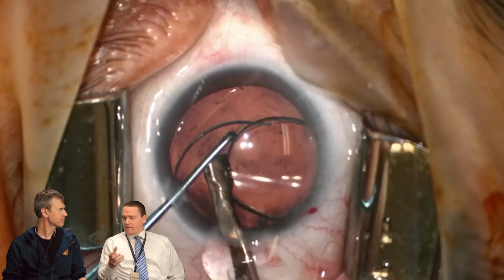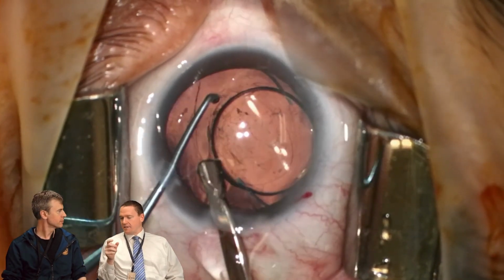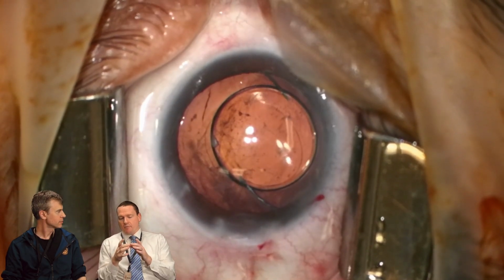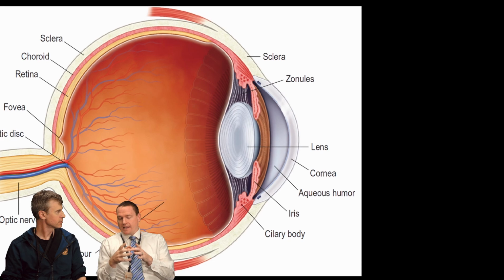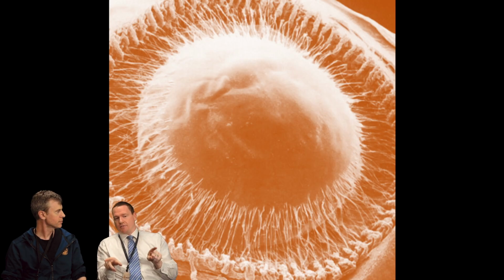Yeah, the actual material itself is made to last for a lifetime, but the challenge is the location, the placement of that lens. Sometimes it's compromised by the patient's anatomy. Where that lens is placed is usually in the capsule, and that can start to dislocate from these string-like fibers, these zonules that hold it in place.